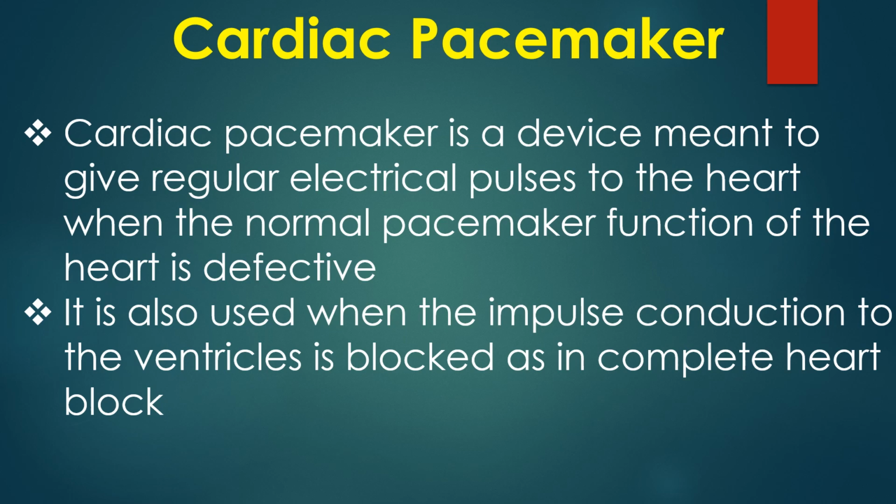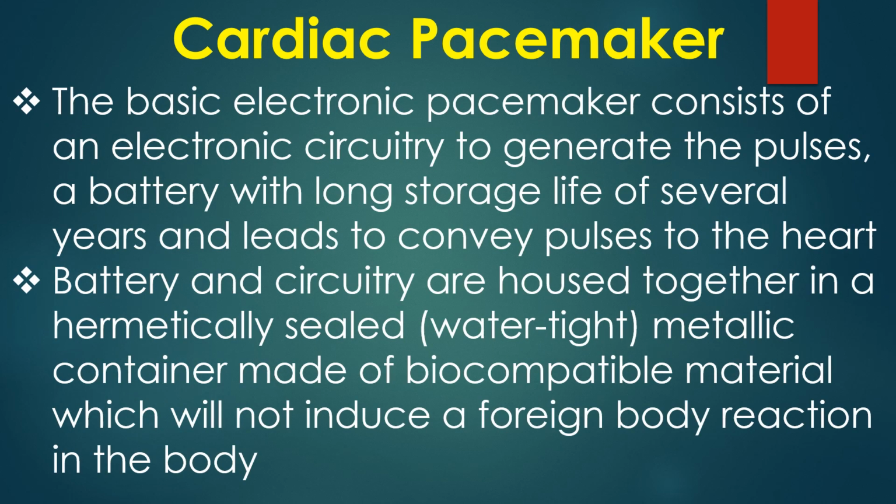It is also used when the pulse conduction to the ventricles is blocked, as in complete heart block. Basic electronic pacemaker consists of an electronic circuitry to generate the pulses, a battery with long storage life of several years, and leads to convey pulses to the heart. Battery and circuitry are housed together in a hermetically sealed metallic container made of biocompatible material which will not induce a foreign body reaction in the body.